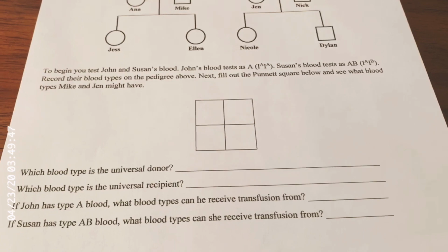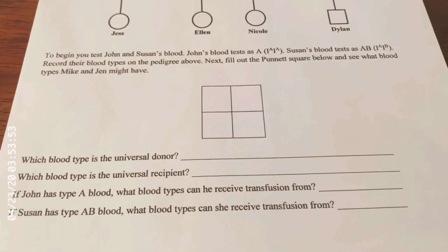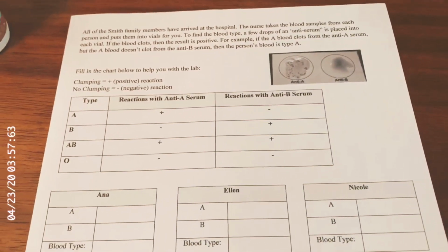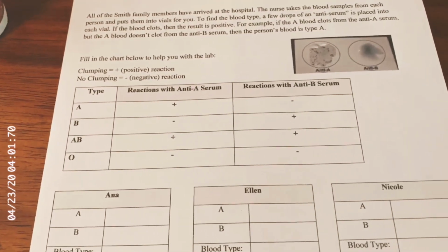The answers to the universal donor and universal recipient questions are in your notes. Okay, all of the Smith family members have arrived to the hospital. The nurse takes the blood samples from each person and puts them in vials for you.